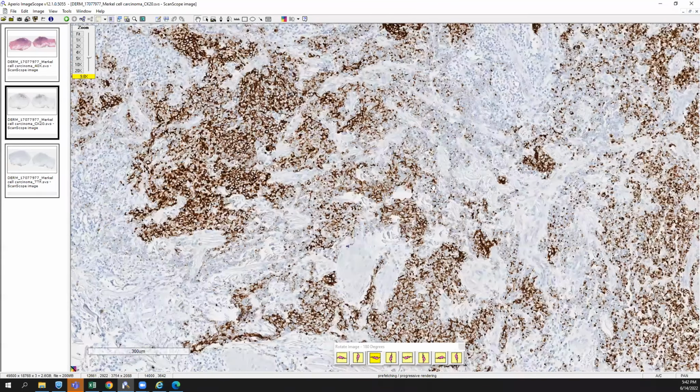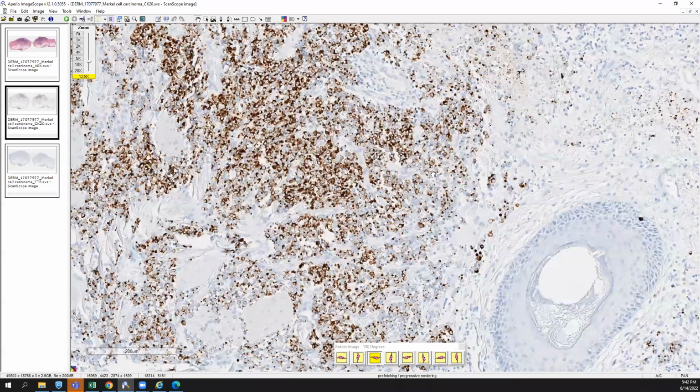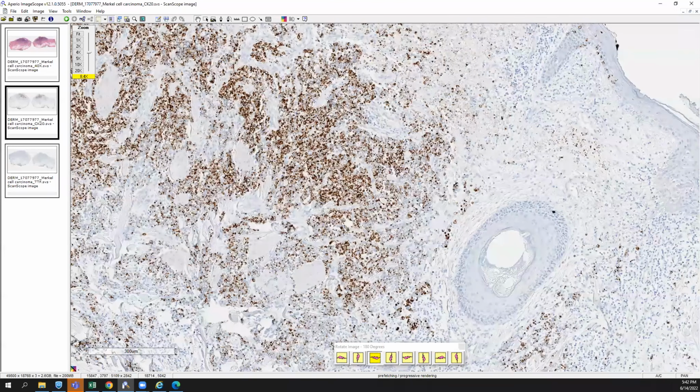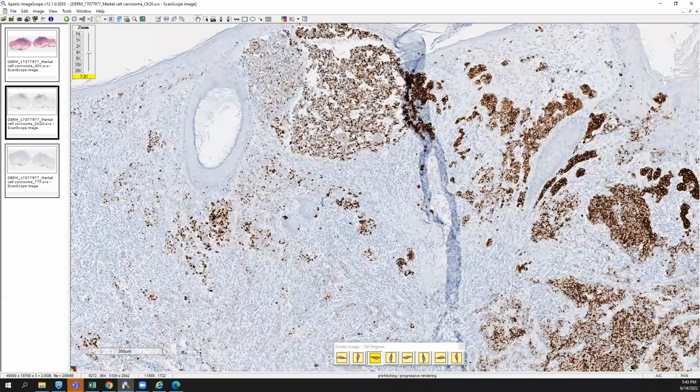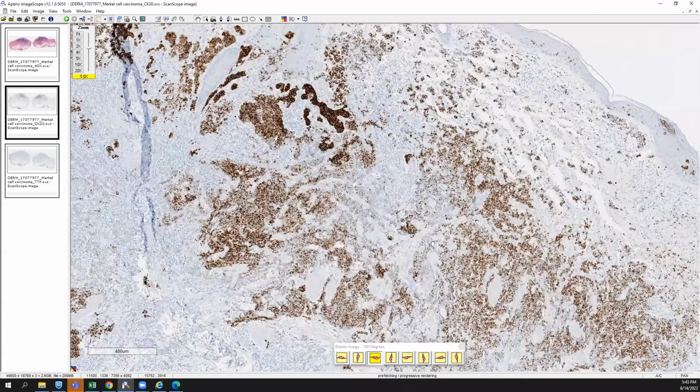In a lot of malignancies, you'll stain for CK20 and it'll just be pretty negative except for just some retained scattered Merkel cells. CK20 can be important in adnexal neoplasms because you'll have retained CK20 just as an aside in the retained Merkel cells, but it won't be diffusely positive like this. So with diffuse positivity of CK20, you can start to think about a Merkel cell.